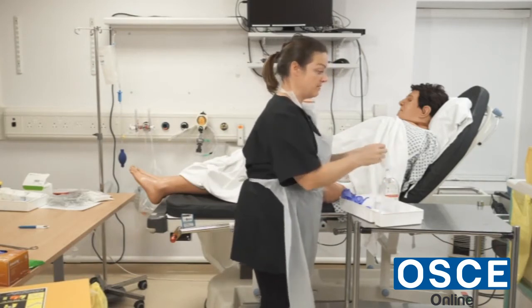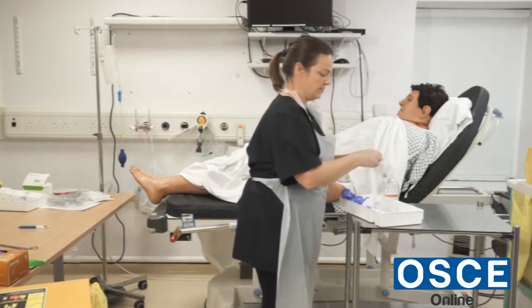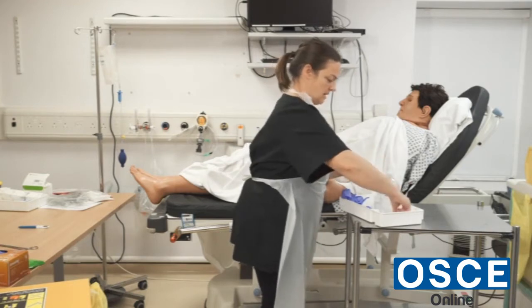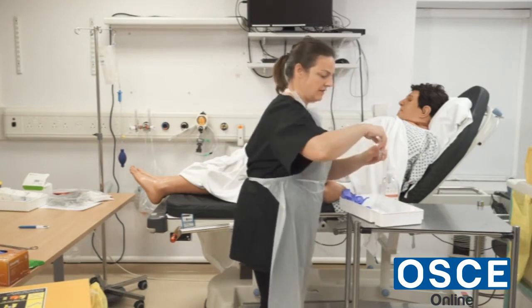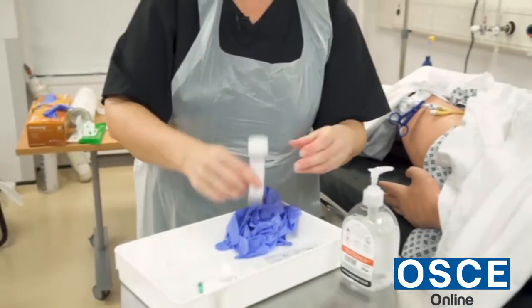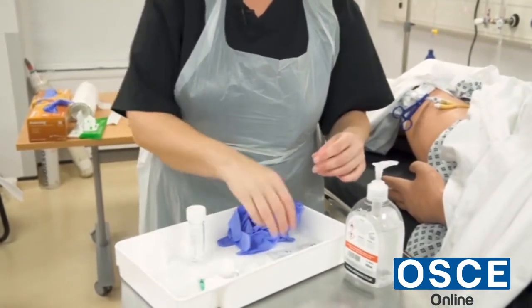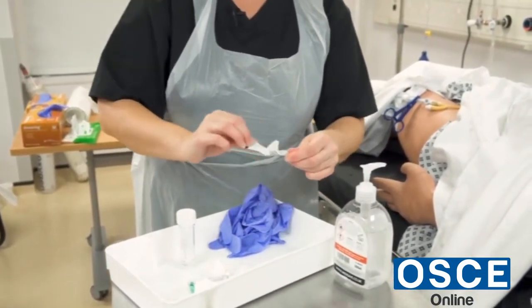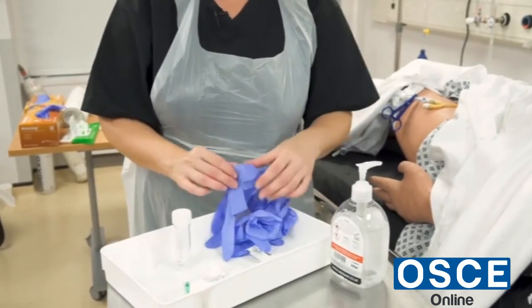I'm going to open the syringe ready at the plunger end, and I'm going to take the lid off the urine sample pot but place it back on to keep it nice and clean and sterile. I'm going to open my first wipe ready.